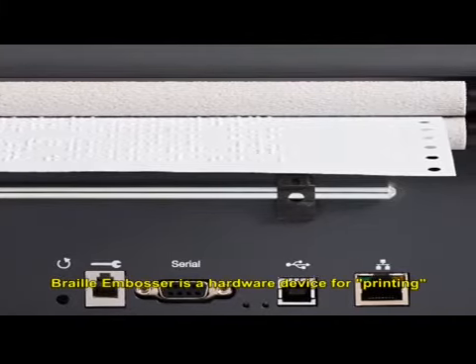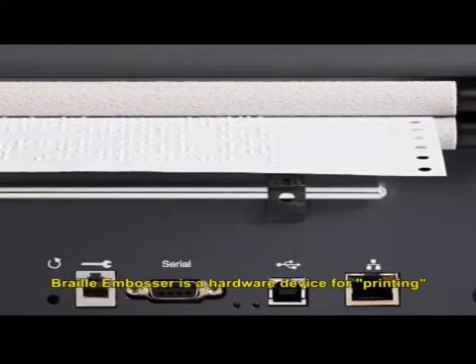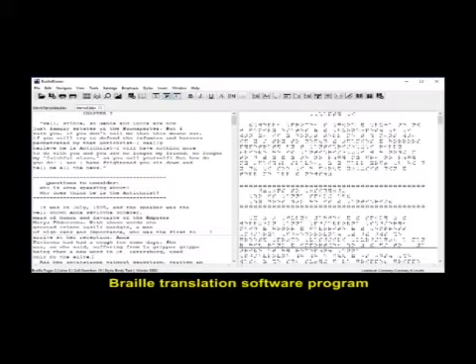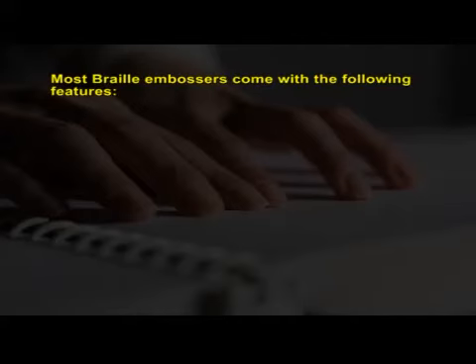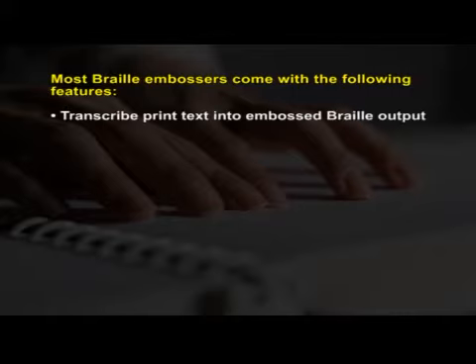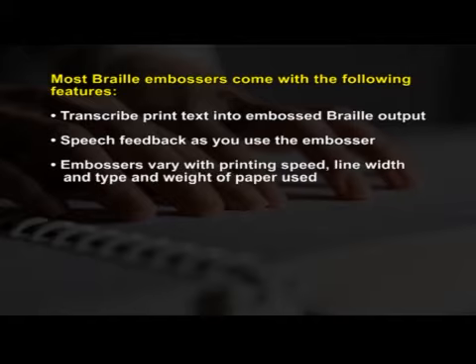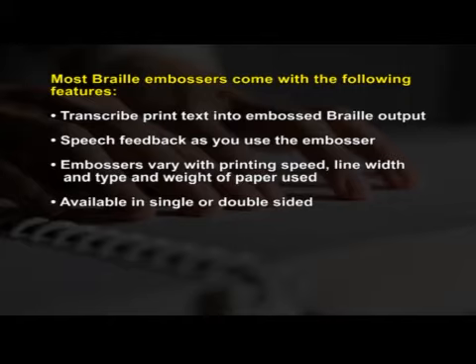A Braille embosser is a hardware device for printing a hard copy of a text document in Braille. A Braille translation software program is required to translate the electronic text from the computer into Braille. Most Braille embossers come with these features. They transcribe print text into embossed Braille output, with speech feedback as you use the embosser. Embossers vary with printing speed, line width, and type and weight of paper used. They are available in single or double-sided formats.